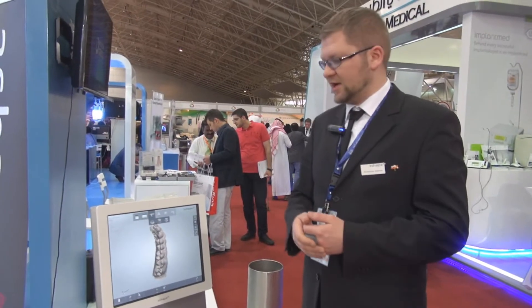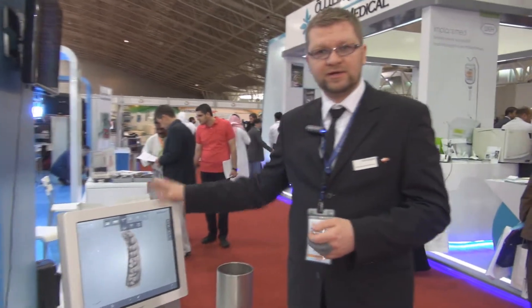Hello, my name is Christopher Adamus. I'm representing 3Shape, a Danish company that manufactures scanners for CAD CAM solutions.